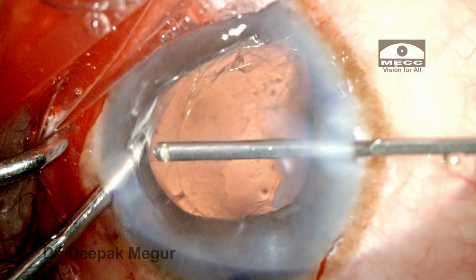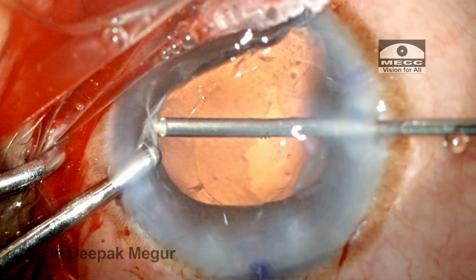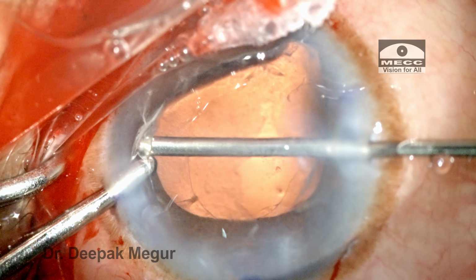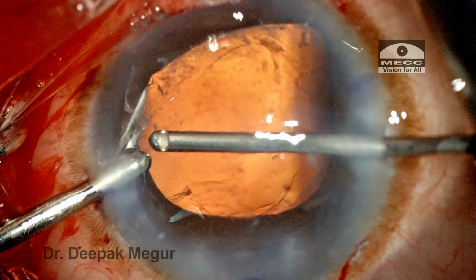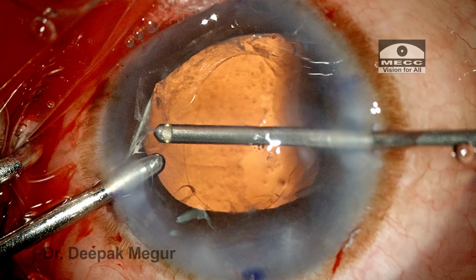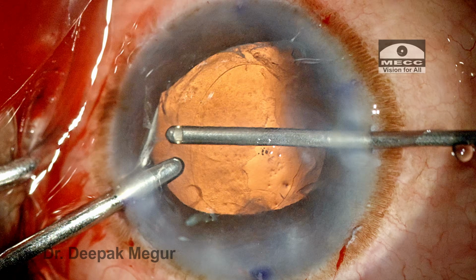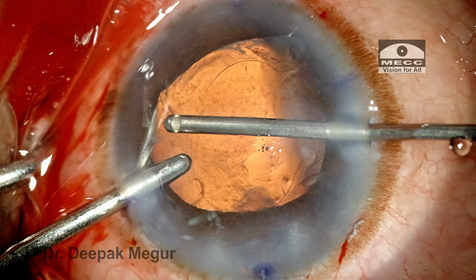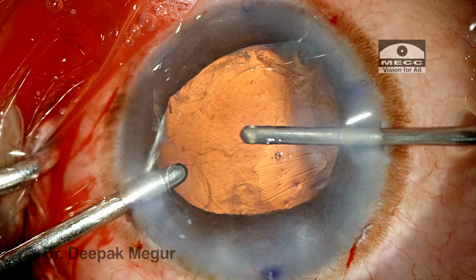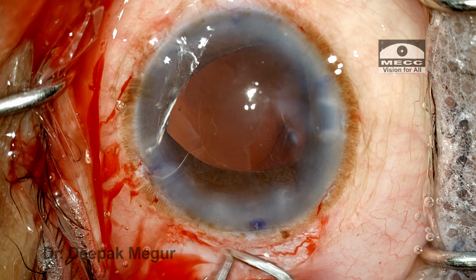So when doing the translimbal approach, one has to be very mindful of not cutting the iris, pupillary sphincter and the rhexis margin, because we'll be working very close to those edges. And the rhexis margin is probably the most sacred part for us, because if we don't have the rhexis intact, then sulcus placement of the lens will not be possible. I did try the limbal anterior vitrectomy in this case, but I realized that this strand was very difficult for me to remove. So eventually I decided to go in and do the pars plana approach for vitrectomy.